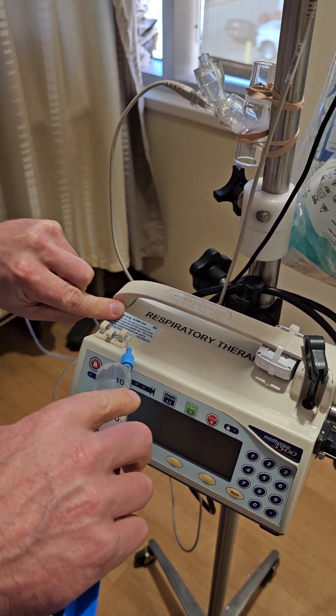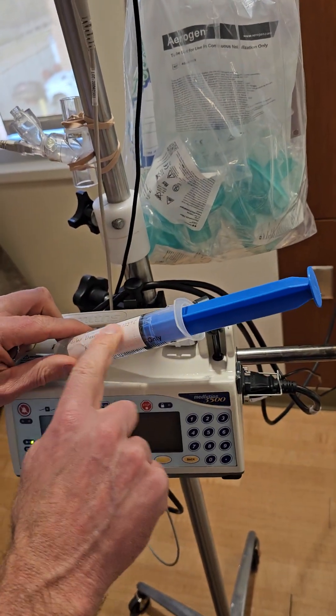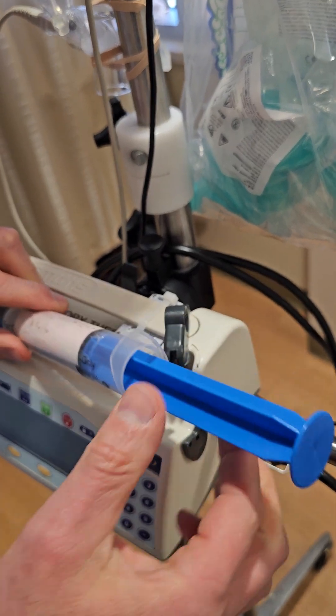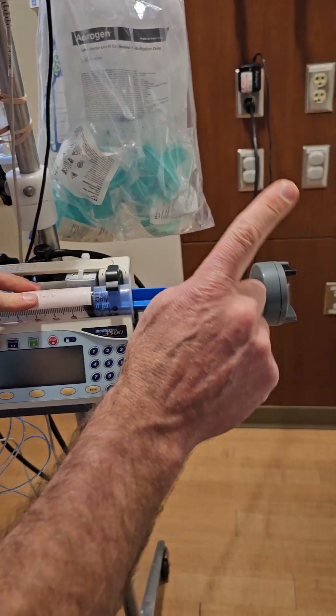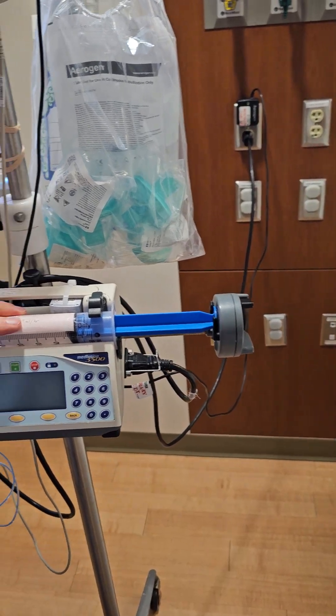We'll go through these little clips with the tubing, place the syringe so that the label is out, and put the flange into the slot here. Then clamp on the syringe.